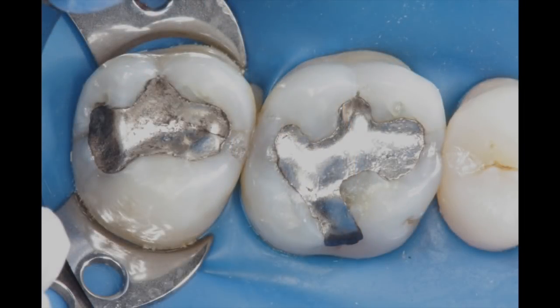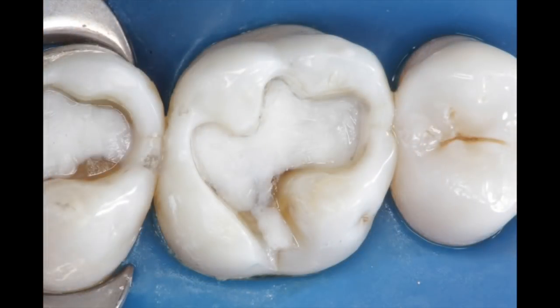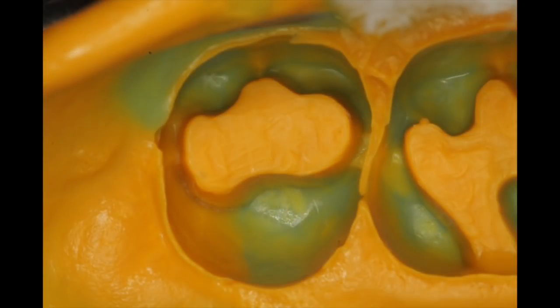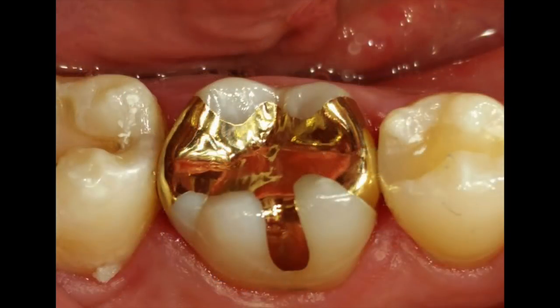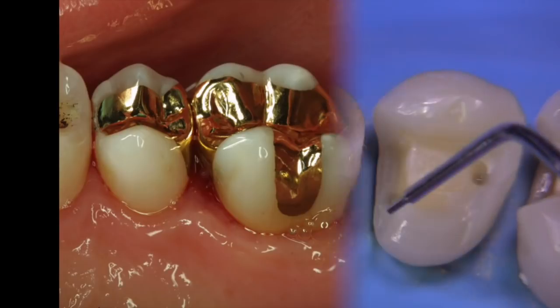A couple of amalgams are failing. We're going to replace these with gold today, and the preparations are completed. That little lingual extension is a hollow grind. Perhaps you can see it a little bit better in the upcoming impression. Here are a couple of cases where hollow grinds have been implemented to solve what used to be a really difficult situation, creating a little box in that lingual or buccal extension. And with the hollow grind technique, a lot of possibilities are presented for us.